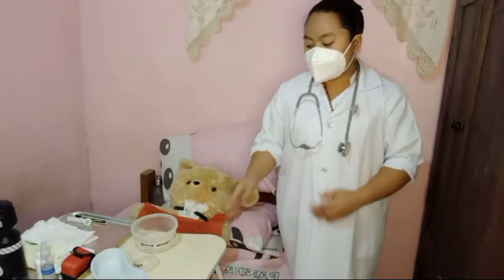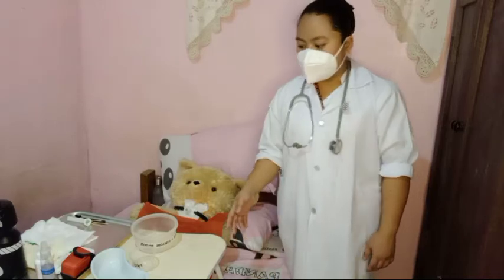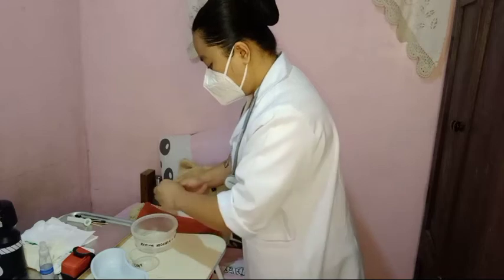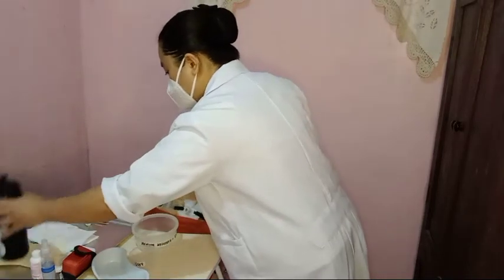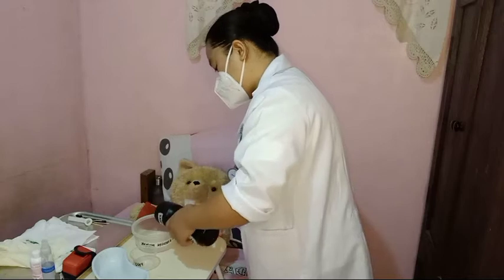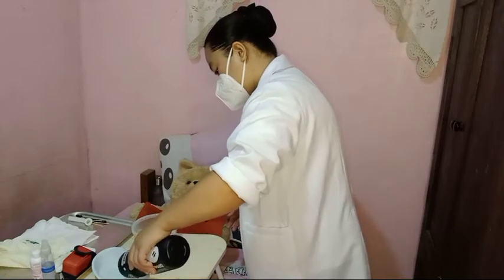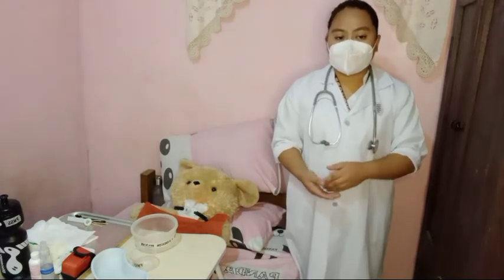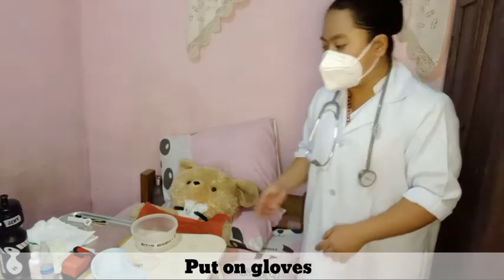Mix sterile water or plain NSS and hydrogen peroxide in a 50-50 ratio. Be sure that it fills 0.5 inch of the basin. And in the other basin, plain NSS that will fill at least half of the basin. And then perform gloving.